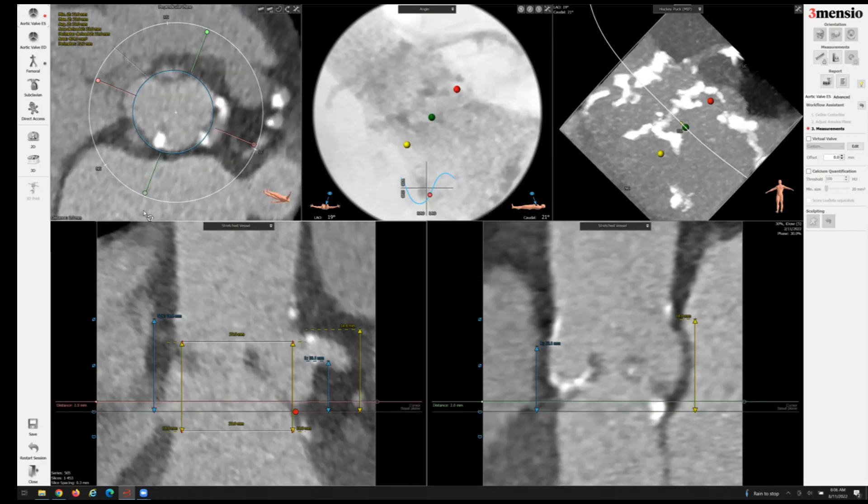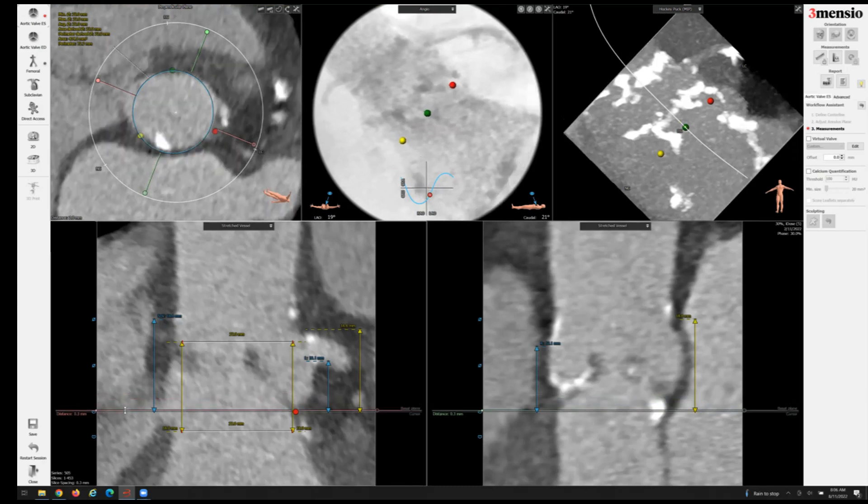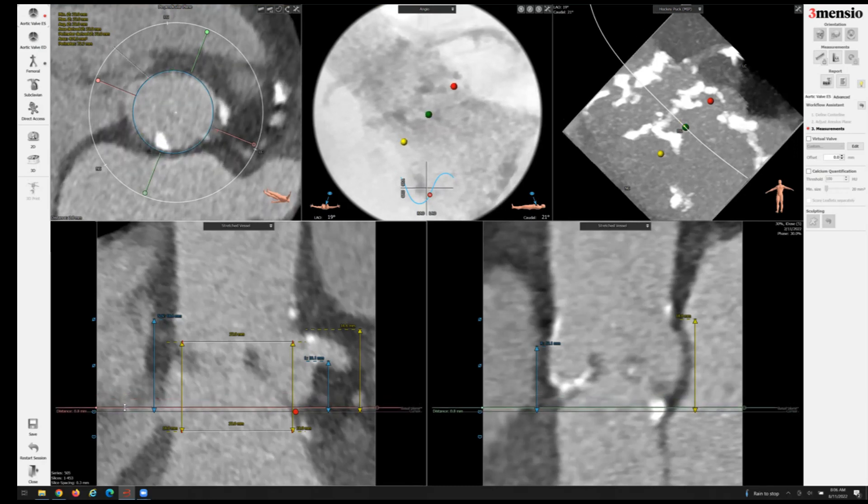This is where potentially aortic root injury may occur if you oversize excessively, especially in a patient with risk factors for root injuries such as being immunocompromised or of very advanced age.